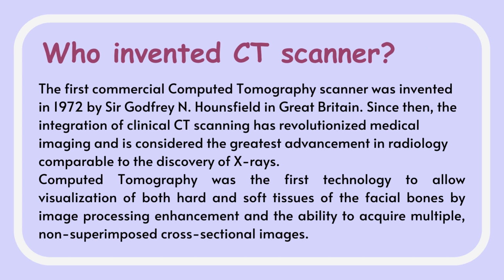Who invented the CT scanner? The first commercial computed tomography scanner was invented in 1972 by Sir Godfrey N. Hounsfield in Great Britain. Since then, the integration of clinical CT scanning has revolutionized medical imaging and is considered the greatest advancement in radiology, comparable to the discovery of X-rays. Computed tomography was the first technology to allow visualization of both hard and soft tissues of the facial bones by image processing enhancement and the ability to acquire multiple non-superimposed cross-sectional images.